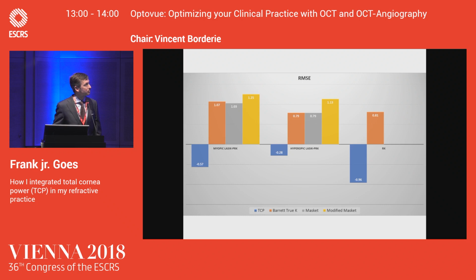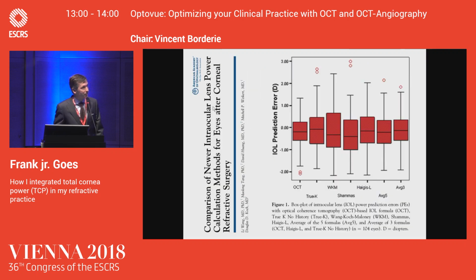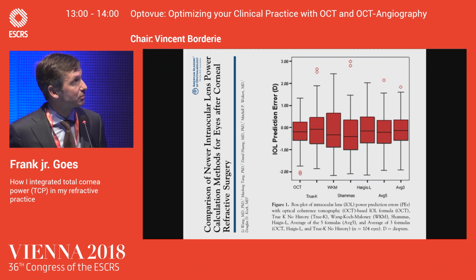There have been a lot of publications on this topic. The group of Professor Douglas Koch and Li Wang published extensively on the subject, and they found the same thing. They also found that the OCT method provided smaller variances of the predicted errors than other methods, and they published it in the Journal of Ophthalmology some years ago, which is a large peer-reviewed journal, of course.